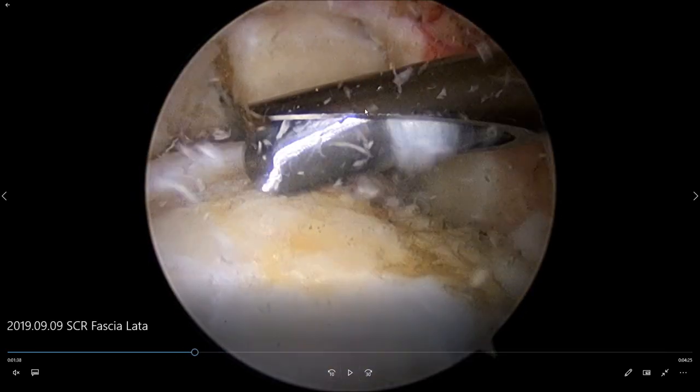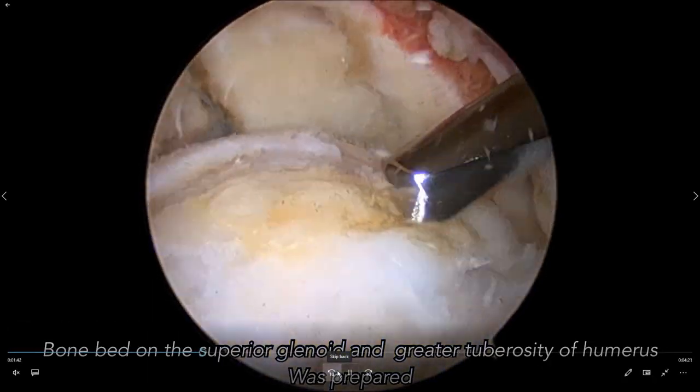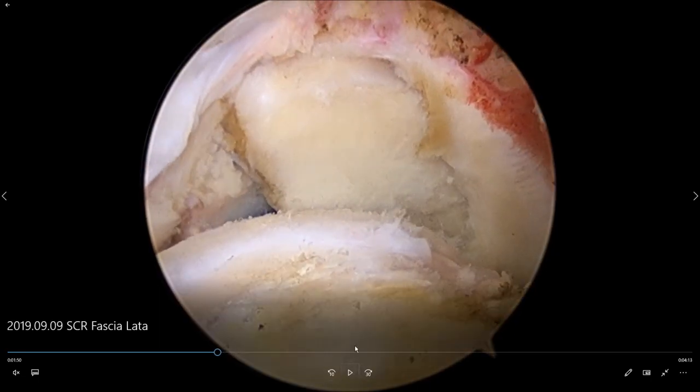Clean the tuberosity, clean the glenoid, and prepare the cuff front and back. This tissue preparation takes some time. You can see that the defect is very big. Clean the glenoid nicely, prepare for the graft to be placed on top. Clean the glenoid, clean the tuberosity, prepare your soft tissue front and back — in the front is the rotator interval, in the back is the remnant of the infraspinatus. It's like a rectangular-shaped defect.